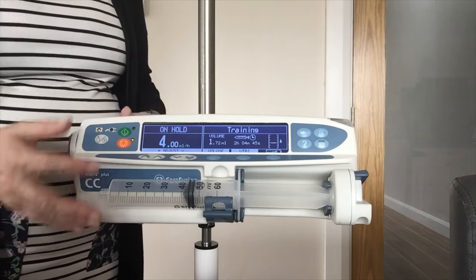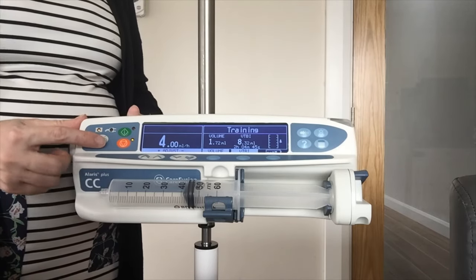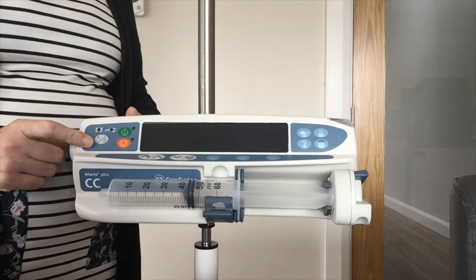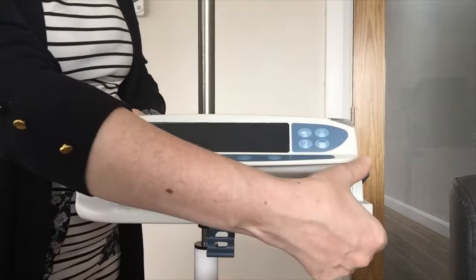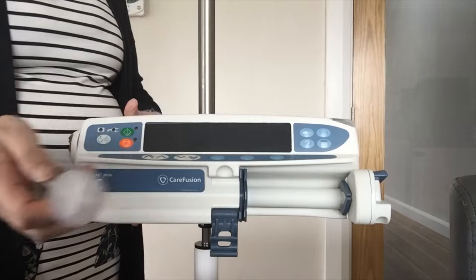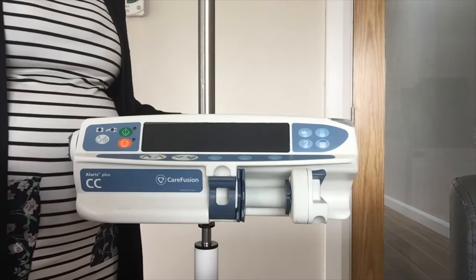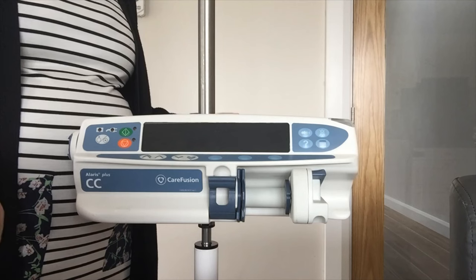To turn your pump off, put the pump on hold, then use your power on/off key — the white key — and keep your finger down until the bar fills and that's your pump powered off. To remove your syringe, which can be done whether the pump is on or off, just bring down your clamp and release your drive — pull your lever down using your thumb and remove your syringe. For storage, put your clamp back up and your drive back in. For any cleaning advice please refer to the directions for use.